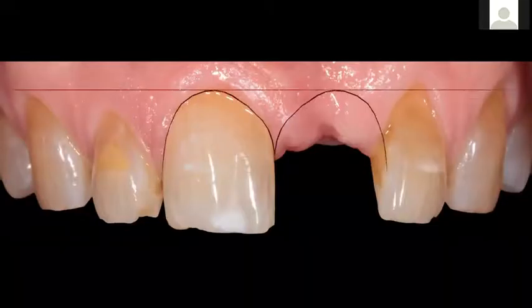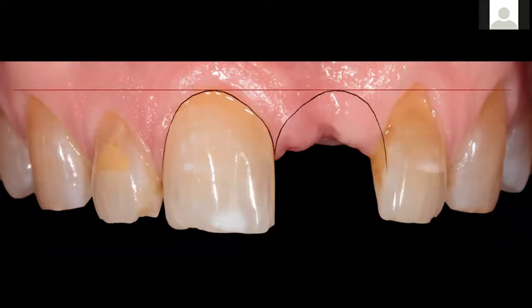Central incisor. And here we can see that's the line that we want. And if we draw this line, we can see that actually the lateral is a little bit too long, and so is the canine, because the lateral should be approximately 1 millimeter coronal to this red line, and the canine should be on par with this red line because it should be right at the same level as the central incisors. These are just basic principles that are obviously taught in the SPEAR facially generated treatment planning module.